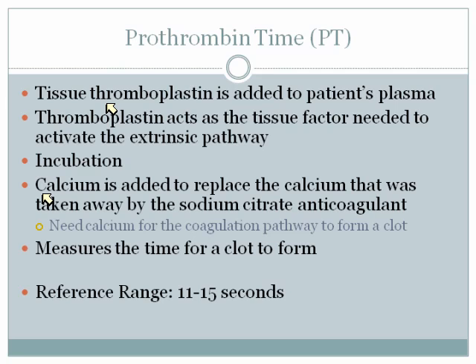With the prothrombin time test, all it's doing is measuring how long it takes for this person to clot. How long does it take in their extrinsic pathway to form a clot? Most people should only take 11 to 15 seconds to form a clot with the extrinsic pathway.